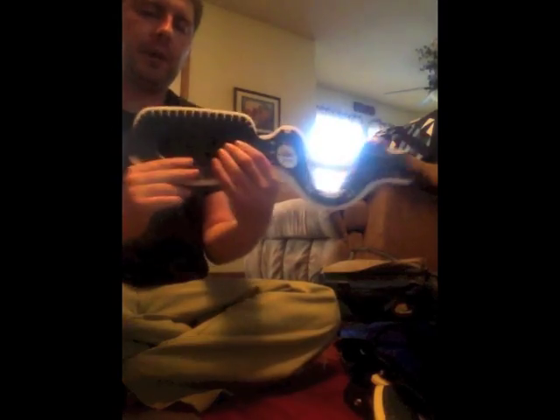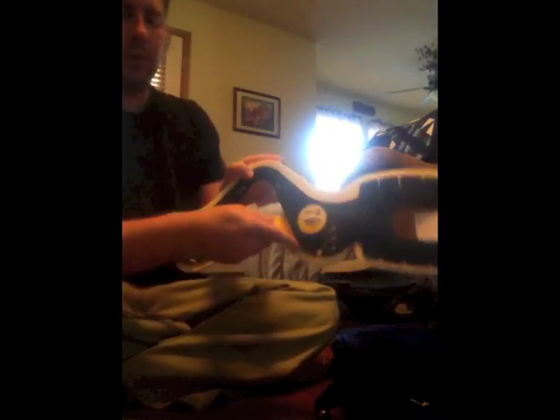So then, I have this. This is my C-collar bag. Cervical collar. Right now, we have two. I'm going to probably get more soon. And we have your adult C-collar, to stabilize the cervical spine. And we also have the pediatric one. Both are from Stifneck, and they have adjustable sizes. The pediatric comes in mid, then mini. With the adult one, you have no neck, tall, regular, short.